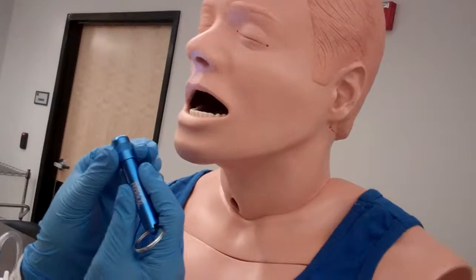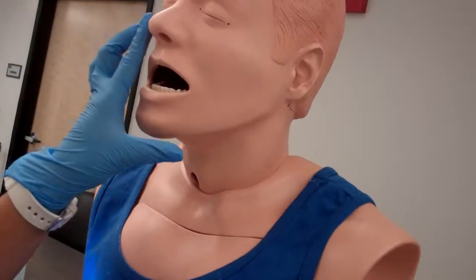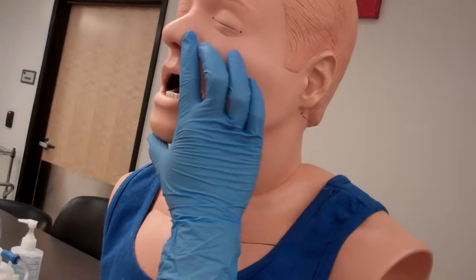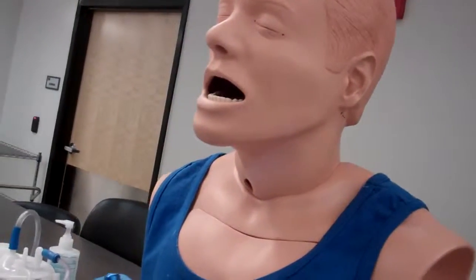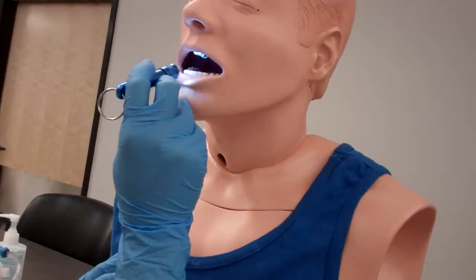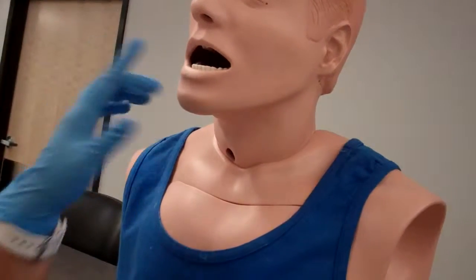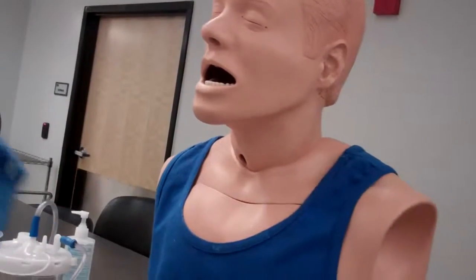So I check each nostril. Okay, so can I have you breathe through one nose? Alright, and then can I have you breathe through the other nose? Okay, so nose is patent. Now I'm going to check the mouth for any lesions or inflammation. None. And then at this moment I would check for gag reflex. And there is a gag reflex.